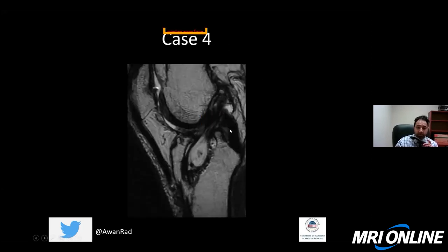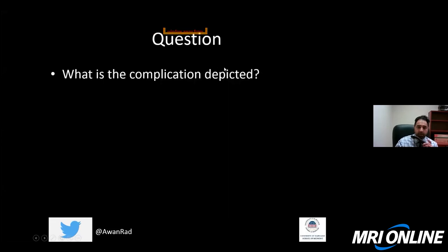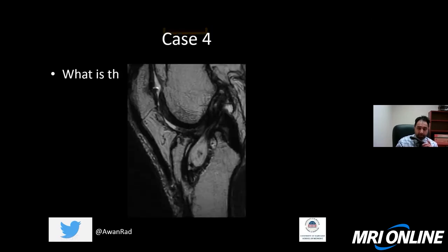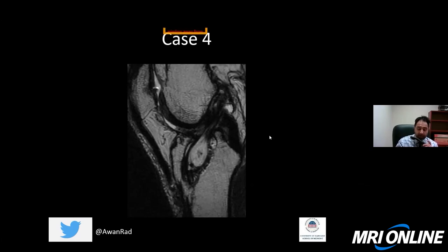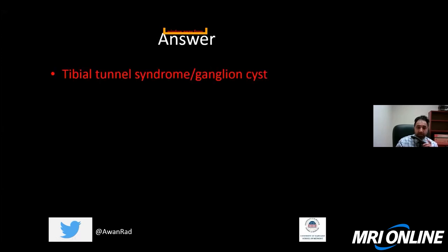Case four: a sagittal T2-weighted image through a patient with ACL reconstruction. The complication shown is tibial tunnel syndrome or ganglion cyst — cystic degeneration of the graft. Notice there's a focal fusiform T2 cystic focus within the graft itself, but the fibers of the graft are not torn. Most attendees correctly identified this as ganglion cyst or tibial tunnel syndrome.